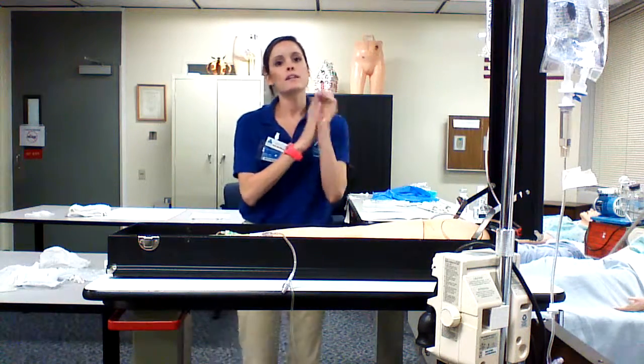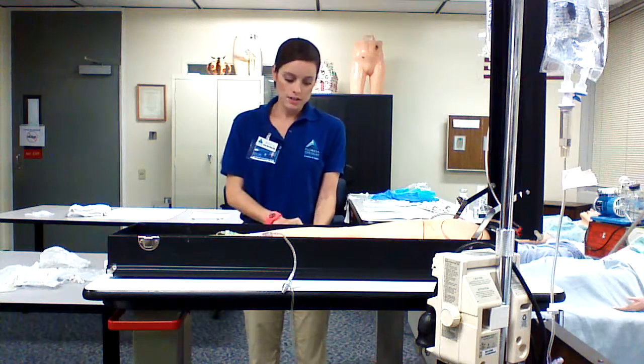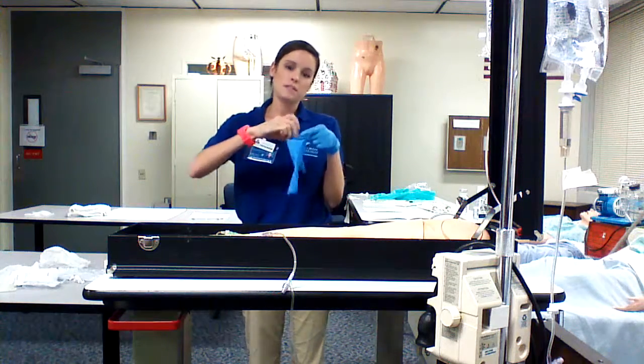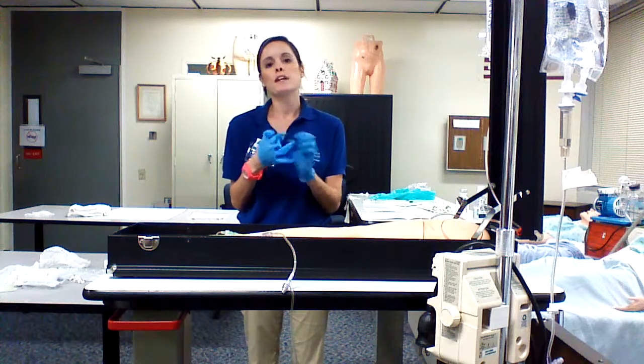So I'm going to wash my hands and apply clean gloves. I'm going to assemble my medication and my solution, and I'm going to add the medication to the mini bag using aseptic technique.